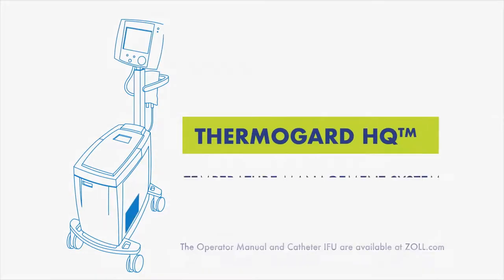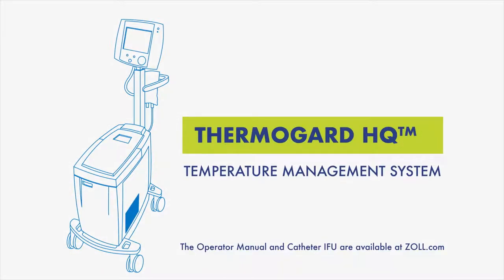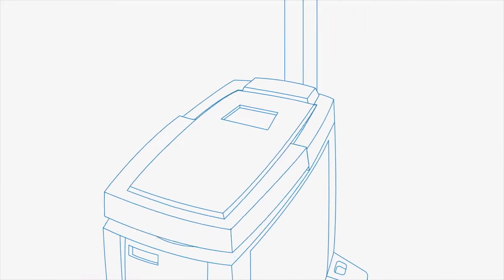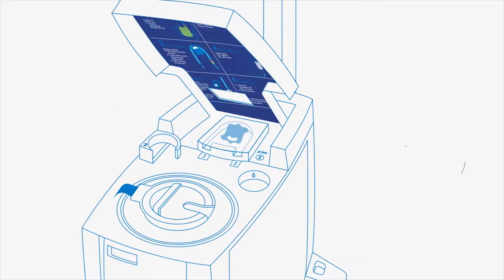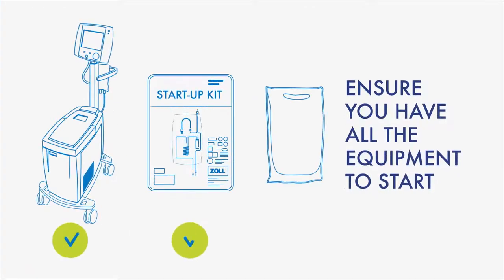Setting up the ThermoGuard HQ system takes 3 to 5 minutes. Setup guides are located on the machine for reference. Ensure you have all the equipment to start.